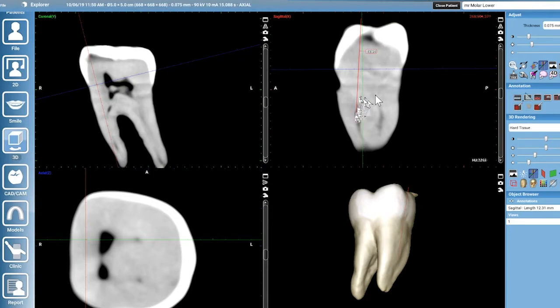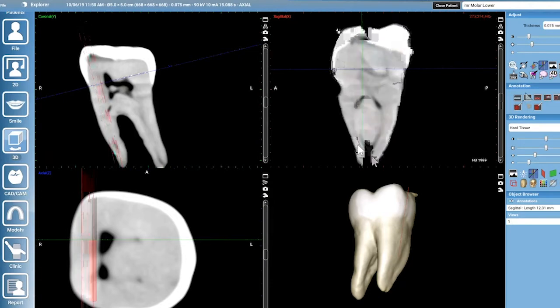Pre-bent the hand file towards the buccal, so coming down the lingual but bending towards the buccal, slid past that little blockage there and managed to get down to working length quite easily. The confluence here, or the joining of the lingual and the buccal, isn't too dynamic a curve, so we slid down there and got working length relatively easily.